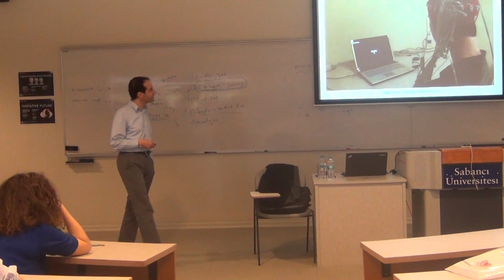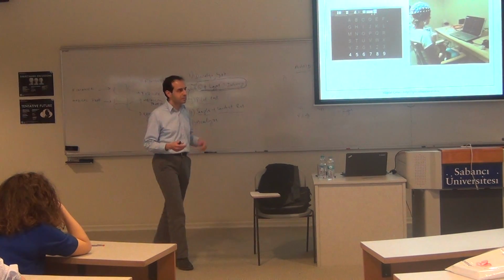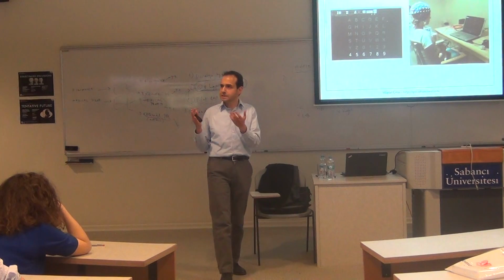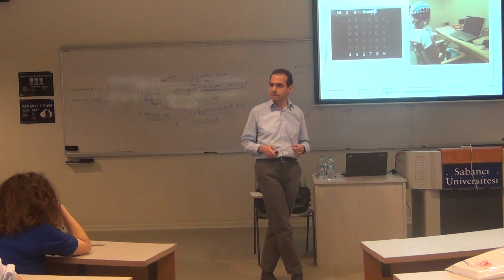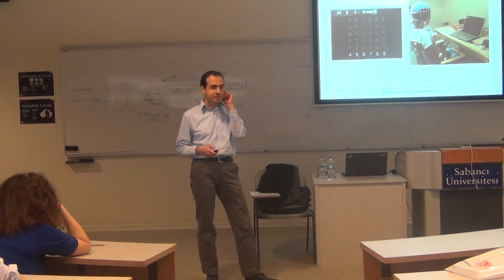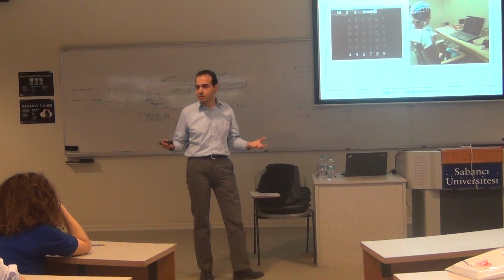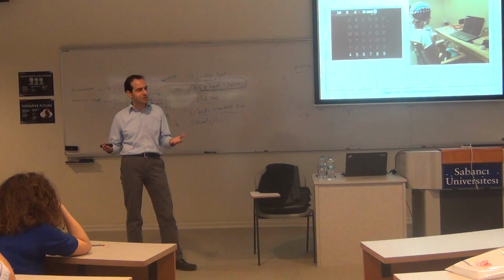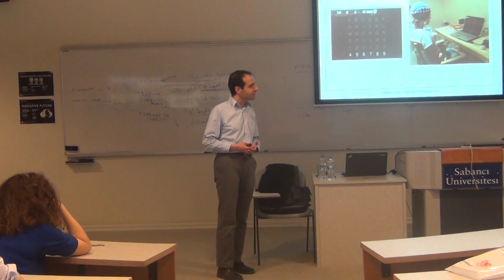Whenever I'm typing a letter, at this point, I'm just using the EEG data that I have collected that corresponds to that letter or that row, etc. However, if I know that the person is typing in a particular language, Turkish or English, you know the structure of the language, you should exploit it, as is done in speech recognition, as your phone does when you're trying to type a word, etc.